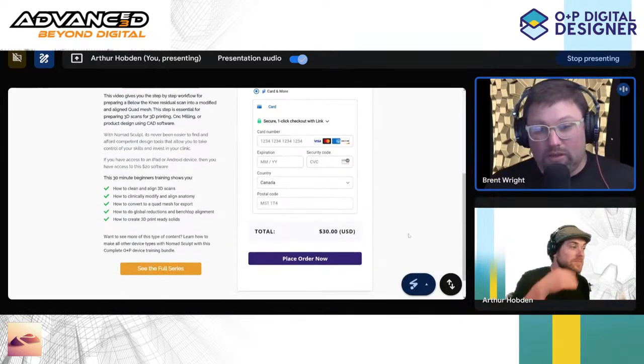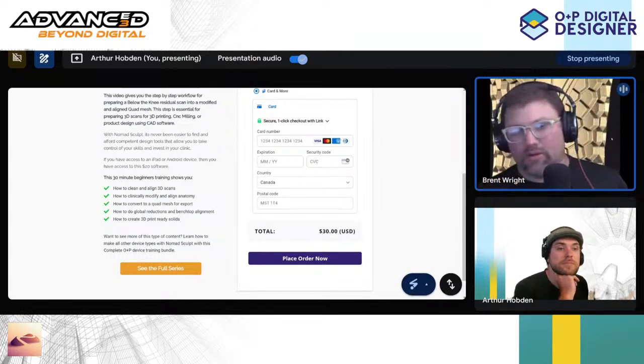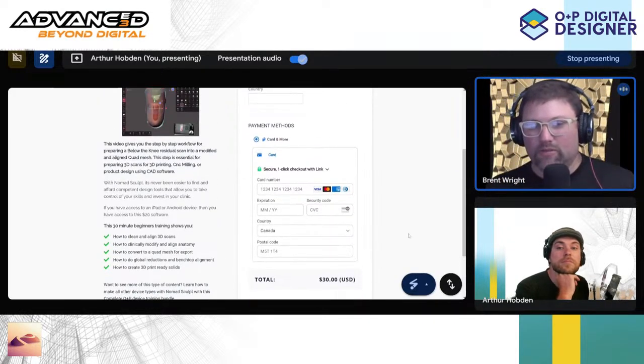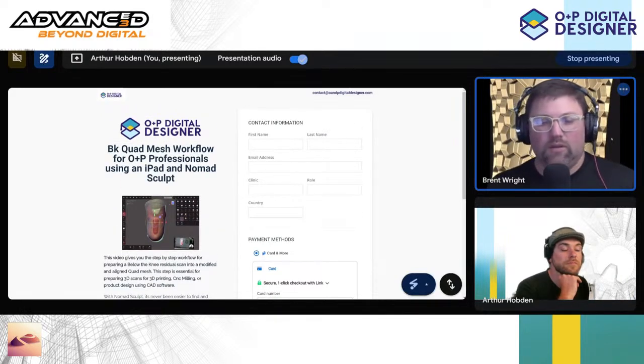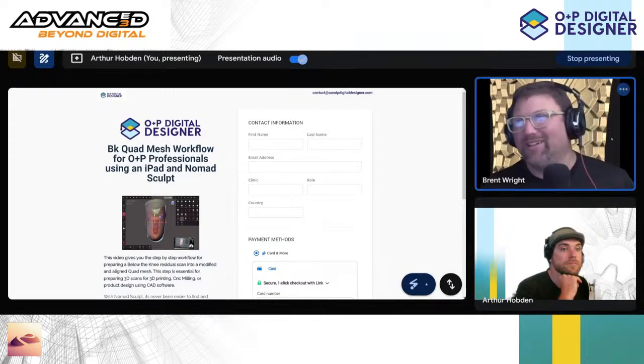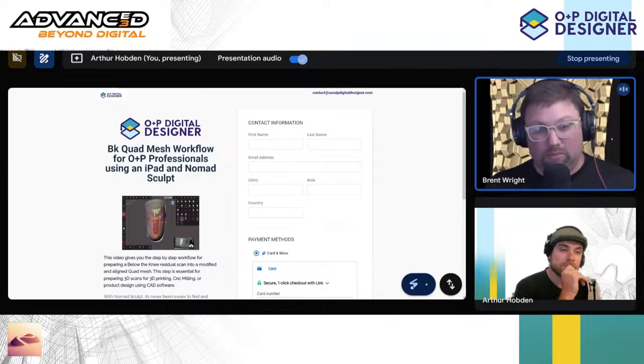Yeah, and I love having all the options, right? If you're a Fusion person and that's what you want to do, then that's perfect. If you're a freeform person, or whatever software, yeah, go do it. But if you're not interested in any of that, that's where I think the web app stuff comes in. Or say you've been using Fusion 360 and it produces beautiful sockets, but it is time consuming and you've got to do it every single time.